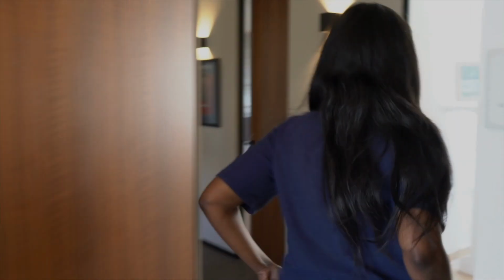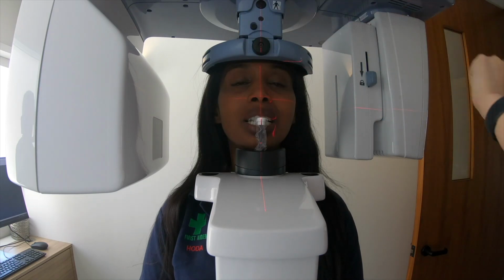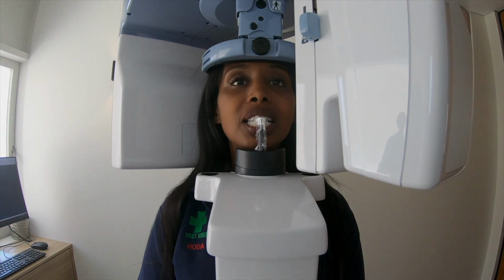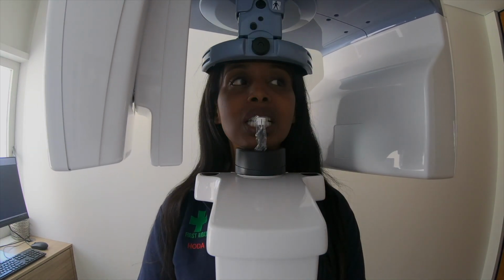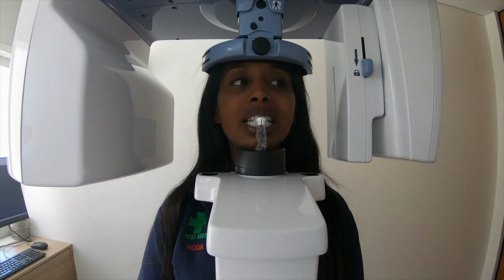So the first is actually a 3D bone scan. 3D bone scans have been around for a long time in the medical field, but as dentists, we haven't been able to buy or have a machine in the practice, and this only changed in 2018. What a 3D bone scan is, it allows us to see the bone not in 2 dimensions like on an X-ray, but in 3 dimensions, so we can actually virtually place all of the implants and know what size and shape and width of the implant to actually place.